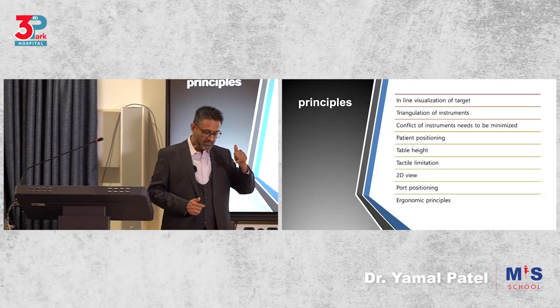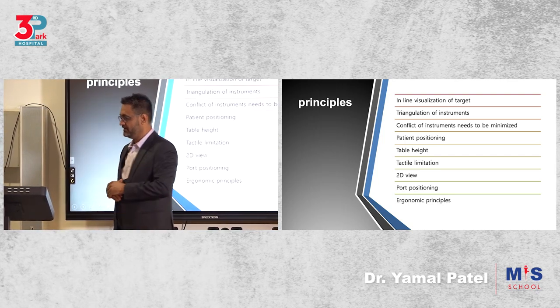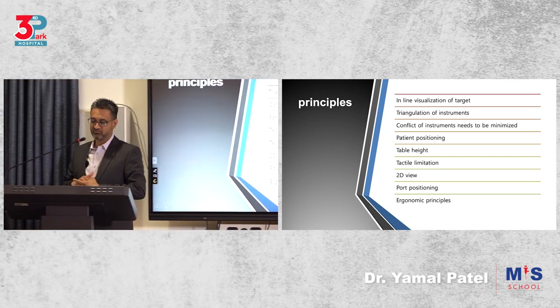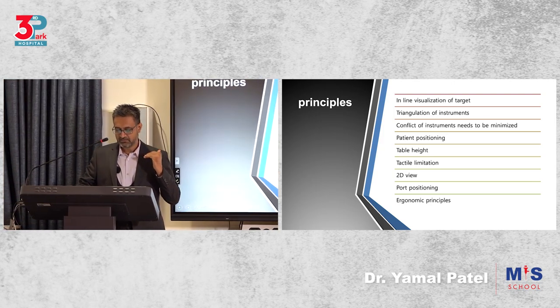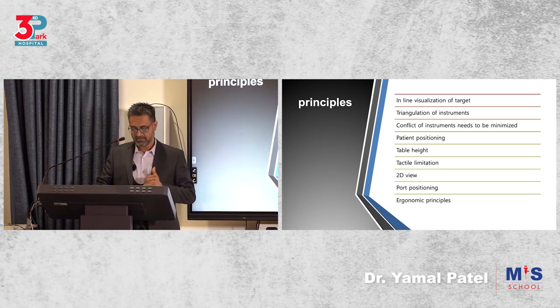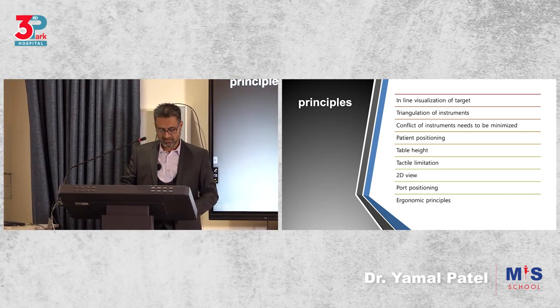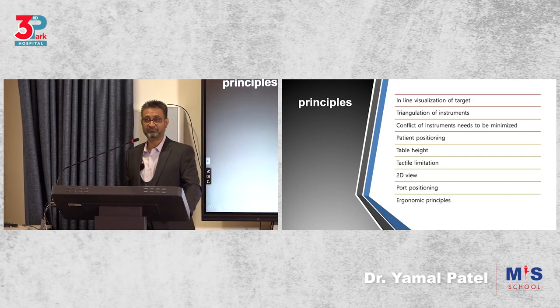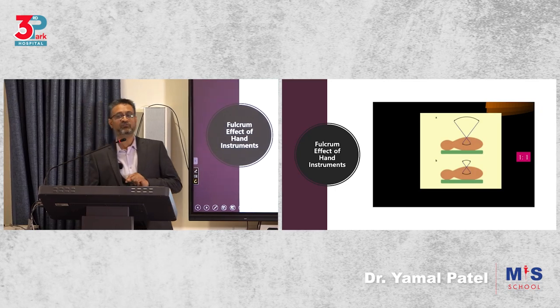Number one, inline visualization of the target, inline, okay? Number two, triangulation of instruments. Number three, we'll talk about patient position, conflict of instruments to be minimized, table height, tactile limitation, port positioning, ergonomics of instruments, ergonomics of principles of port placement. We need to know the fulcrum effect.